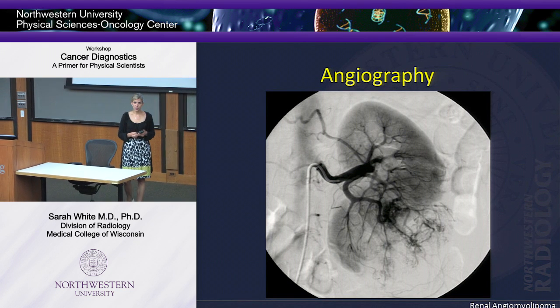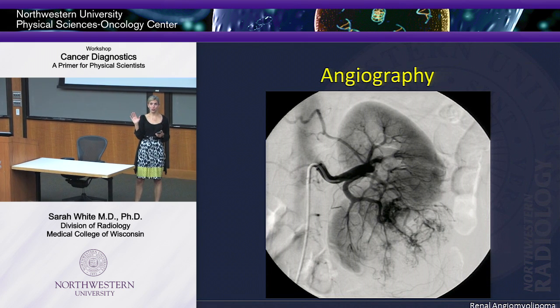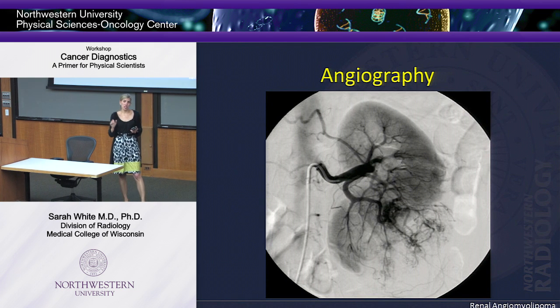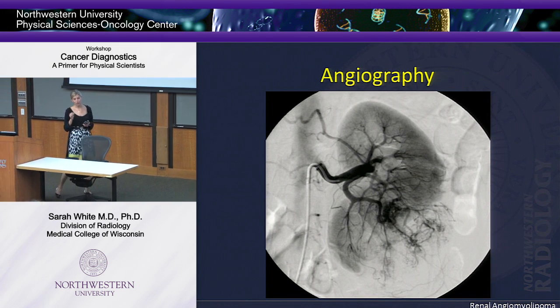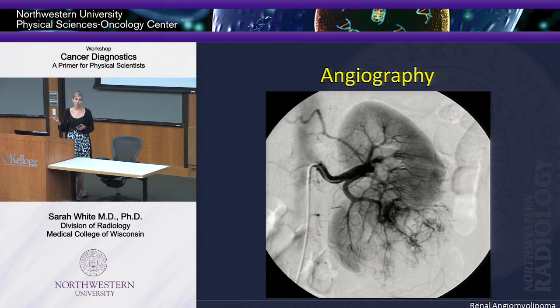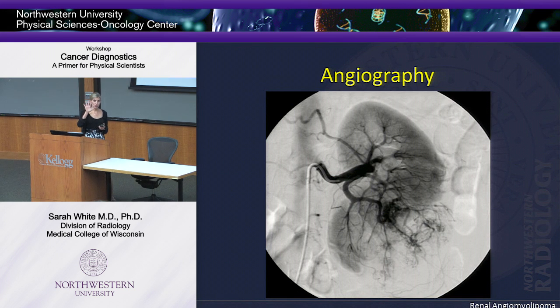And so what he decided was maybe I can subtract the X-ray from all the other images so I only see contrast. Okay, he's like, let's try it. So he did. It's called digital subtraction angiography. I use it every single day of my life. Okay, this is a picture from a digital subtraction angiography. We took a picture, and then we subtracted every other image out. So you can imagine if the patient breathes, you're not going to get a beautiful picture because the subtracted image isn't going to match up with the picture that you have on the screen.